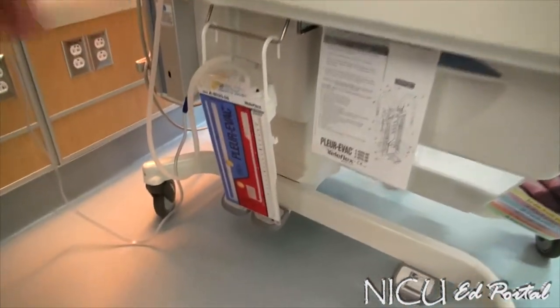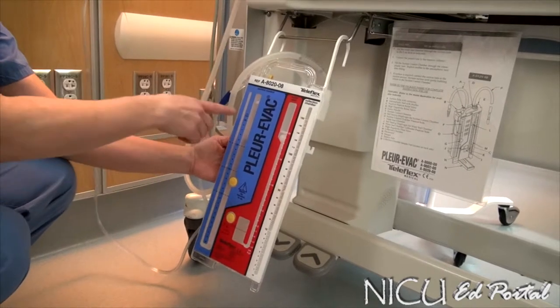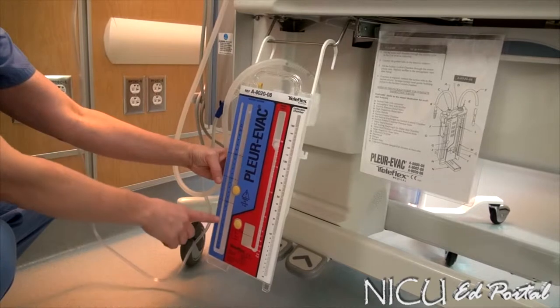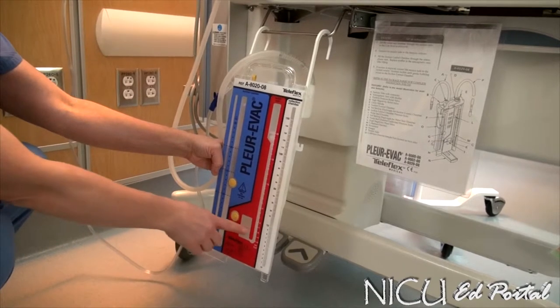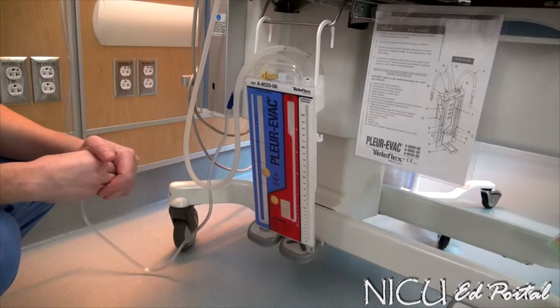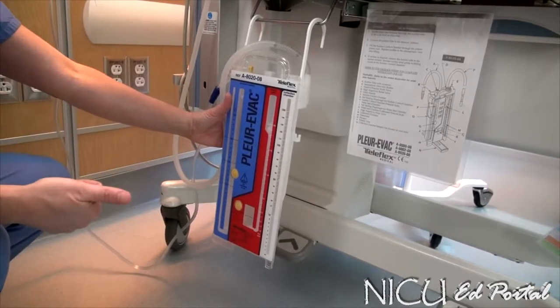This here is your drainage system, the Pleur-evac Infant Unit. This system has three chambers that you need to be familiar with. It has a suction control chamber, which is basically what the provider orders — how many centimeters of water suction. Your water seal chamber is the second chamber that we will fill to the line, and we will walk through what that looks like with air evacuated and with a pneumo that's still happening.